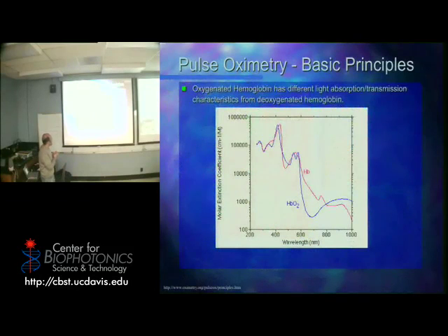So, what you see here is the hemoglobin with oxygen. Sorry for the color choices here. This is not a good color choice because blue and red are opposites and all that kind of stuff. This is a chart that I found somewhere. Not the best color choices. But what you see is the wavelengths. What are the wavelengths around 700? What color is that? Red.